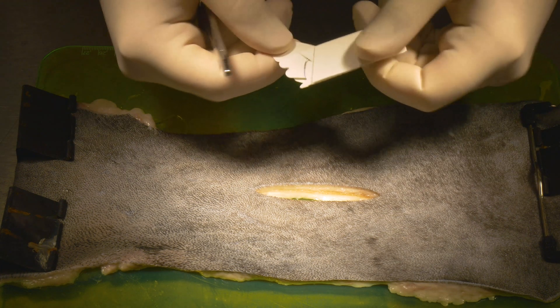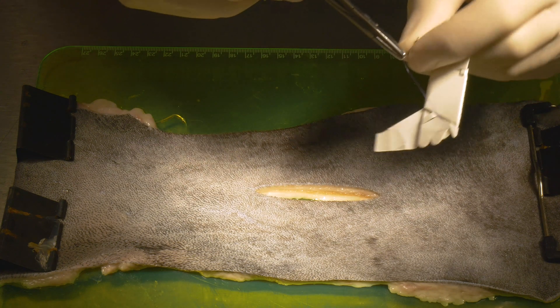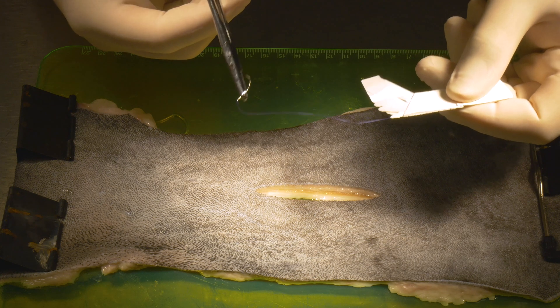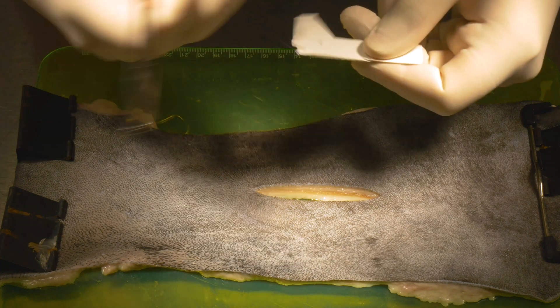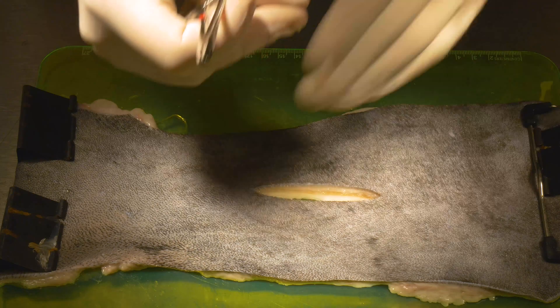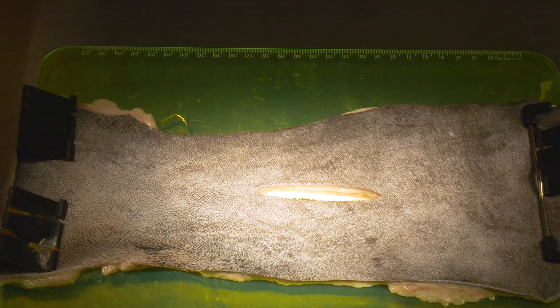When using your suture, the needle always comes at one end of the pack. Oftentimes there's a little triangle that you can fold over. Grab your needle and set it, and then importantly, don't just pull your suture out — you want to make sure you're controlling it so it doesn't fly out of your sterile field. I'll use my three fingers and wrap the suture around them. To get rid of the memory in the suture, I'll then gently pull and stretch it so it lays out more flat and not all curlicued.